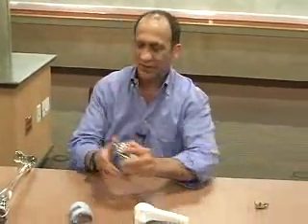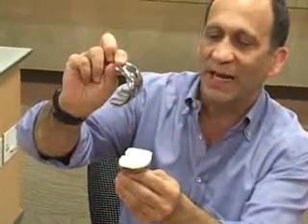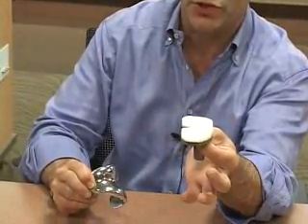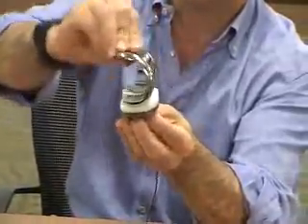So if this is a model of a complete knee replacement, this is the portion that goes over the end of the femur or thigh bone, and this is the portion that sits inside the tibia or shin bone. And you can see there's a plastic insert between, and the way it articulates is so.